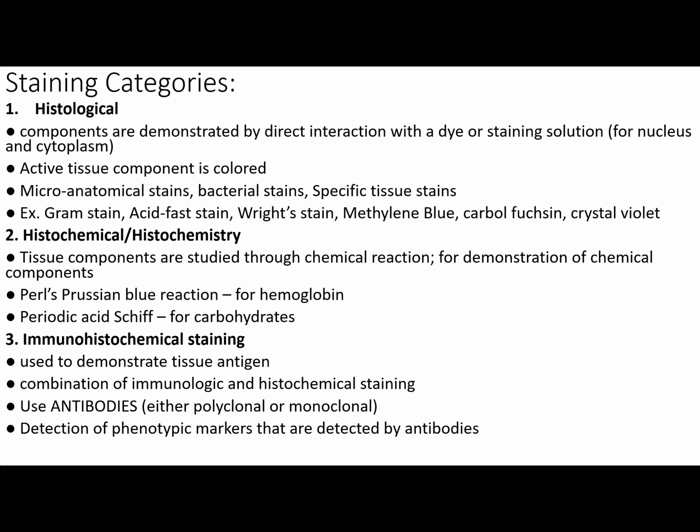Now, this is a combination of immunologic and histochemical staining. It uses antibodies that are either polyclonal or monoclonal. Phenotypic markers are detected by antibodies.